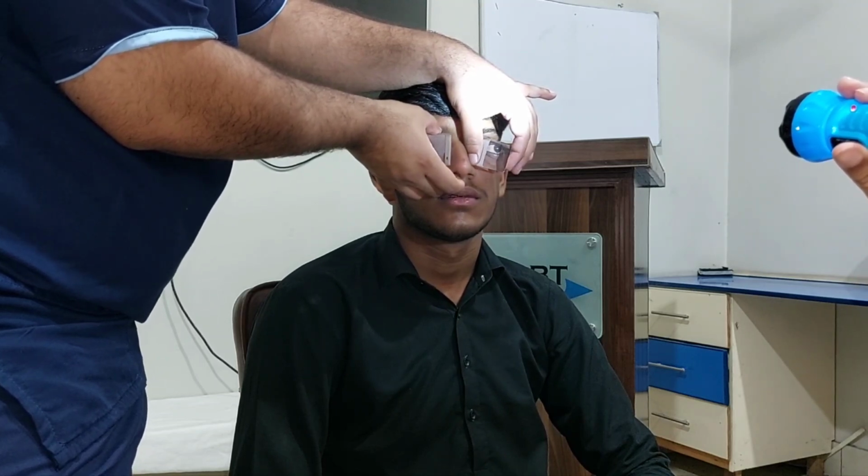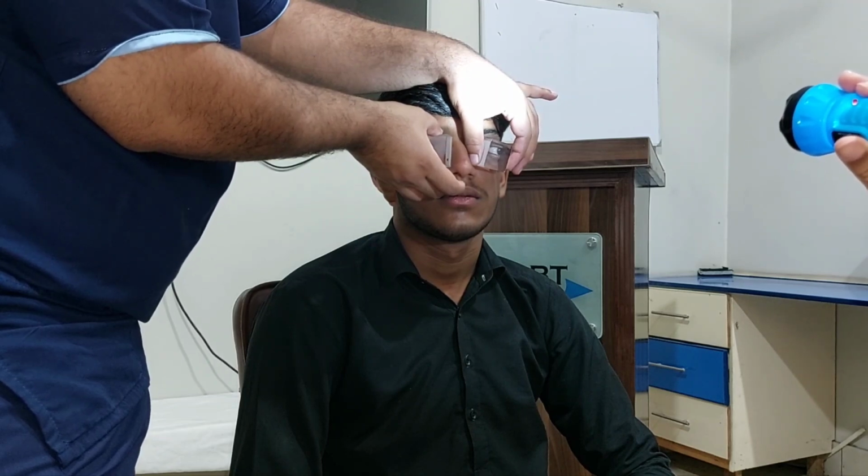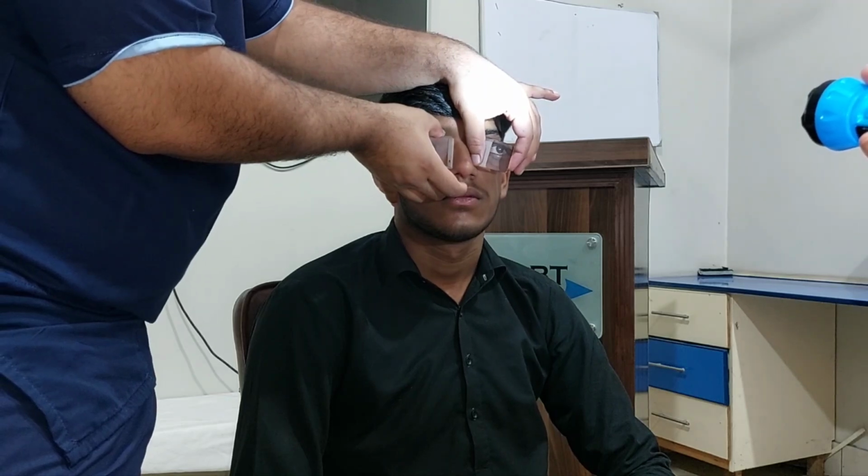So now we have placed 95 prism diopters in front of his eyes, and the Hirschberg is almost central now. Okay, good. That's all.